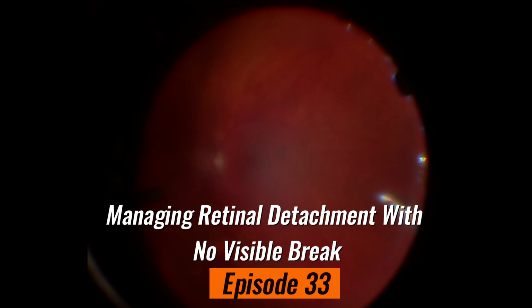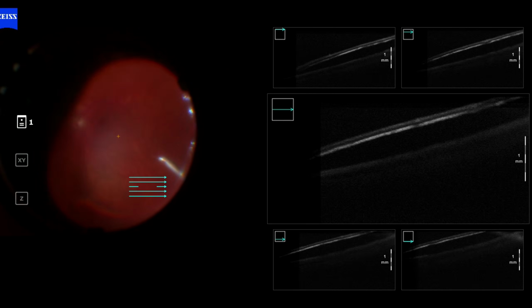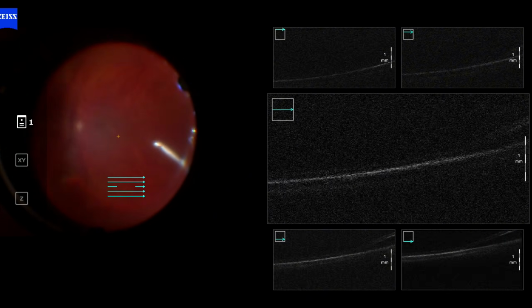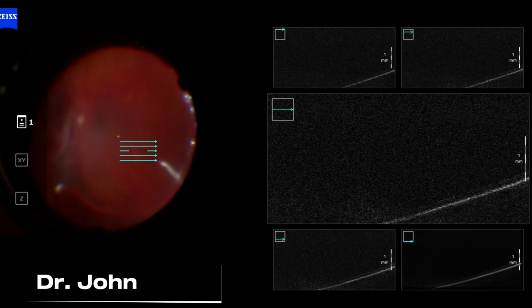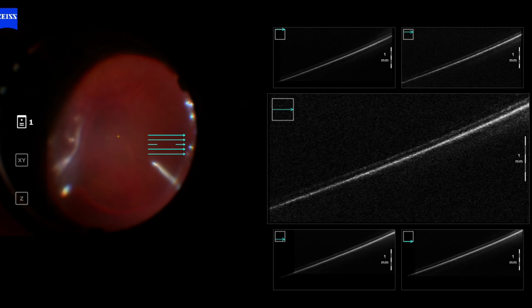In this video we will discuss vitrectomy of a pseudophakic high myope patient with a multifocal IOL who presented with a macula-on shallow retinal detachment and no identifiable break. This case is from my fellowship training and I want to thank Dr. Galic for sharing his technique with us.